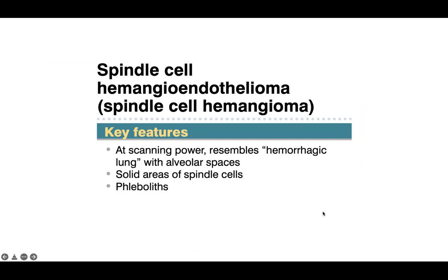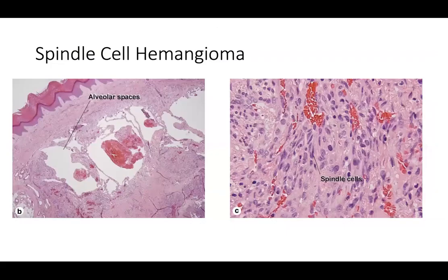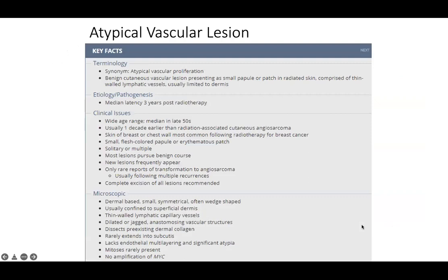At scanning power, spindle cell hemangioma resembles a hemorrhagic lung with alveolar spaces, solid areas of spindle cells, and phleboliths. You'll find collections of thrombi or phleboliths, diffuse erythrocytes within ectatic walls, and a spindle cell proliferation at the outer edges of these dilated alveolar-like spaces. More examples show those alveolar-like spaces with thrombi scattered throughout and the spindle cell proliferation surrounding them.